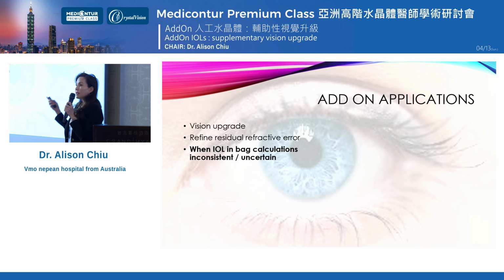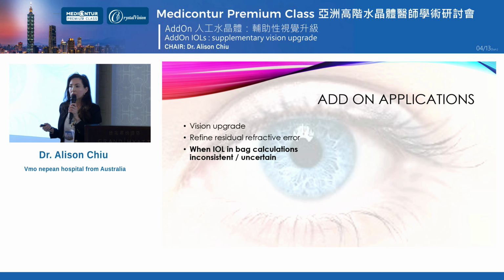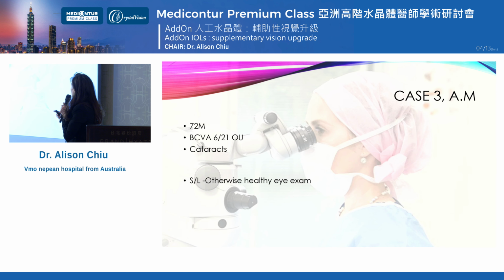So then the next case I want to present to you is when the IOL in the bag calculation, so just the biometry, is inconsistent or uncertain. So this is a 72-year-old man, best corrected vision 6/21, got cataracts in both eyes, otherwise healthy exam, just been wearing glasses most of his life.